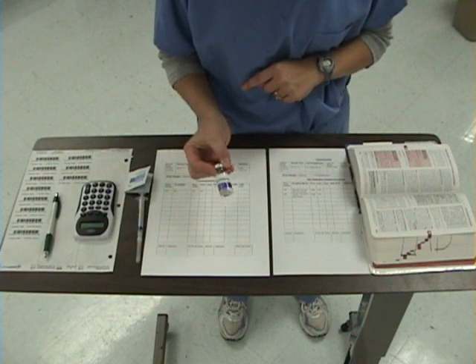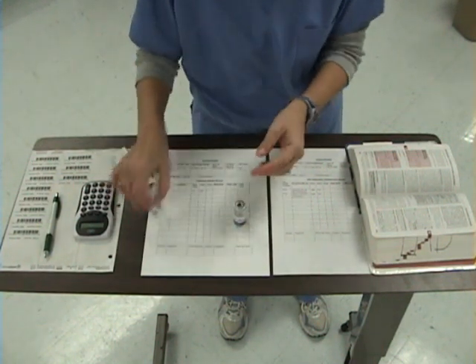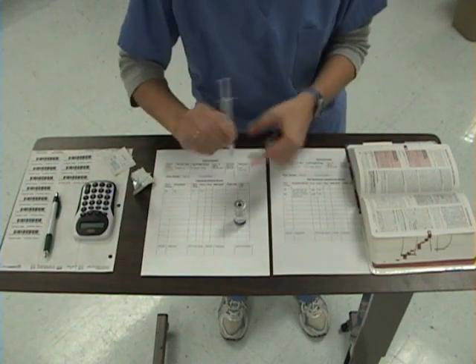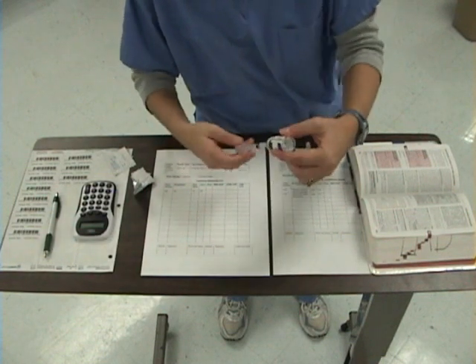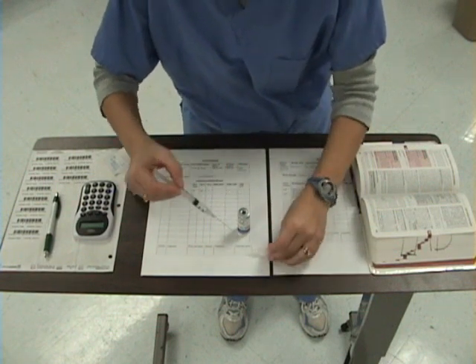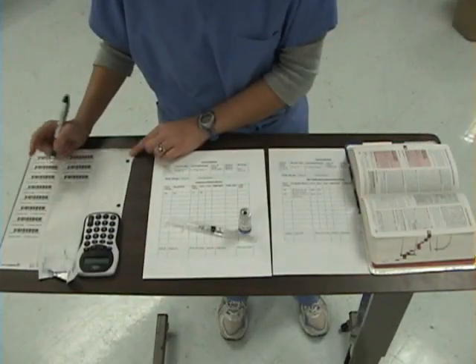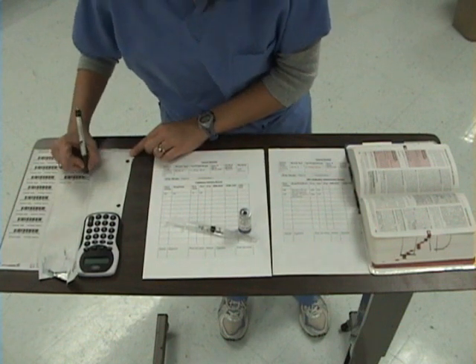I will withdraw 1 ml of Reglan from my vial. On a patient label, I will write the drug, the route, and the dose.